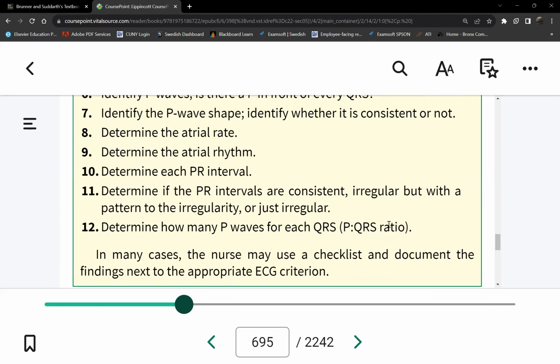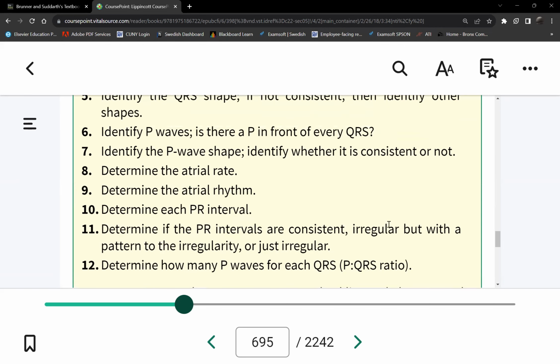So for this box, this is how we have to do it for the quiz or the exam? Not really, because again, I'm giving you the strips, so it's not necessary, but you do need to count the heart rate, okay, for you to know if this is normal or not, because the first step is always count the heart rate. So if the heart rate's between 60 to 100, is that normal? Yes. If it's less than 60, no. If it's more than 100, no. See my point? First step is always count the heart rate, and then you can go whichever step you want there.